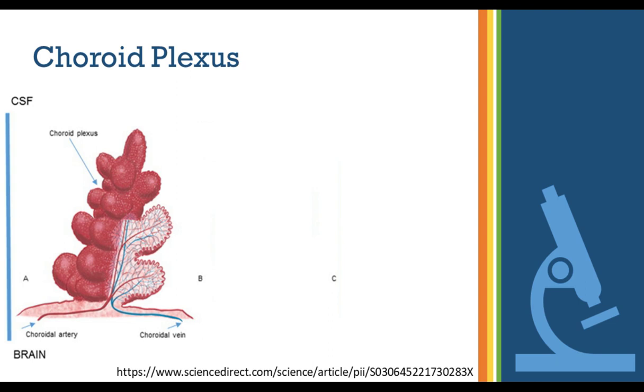Now, Dr. Delery, how is the choroid plexus taken? Perfect. Like I mentioned with necropsy, they cut the skull open and you're able to pull out the choroid plexus. It looks like a kind of red string inside the brain, and in the back by the occipital lobe, you're actually able to see part of it. We have veterinary pathologists who are skilled at the brain and different parts of the body, and they were able to pull out the red string of the choroid plexus and put it into a tube of PBS with us. Next question?